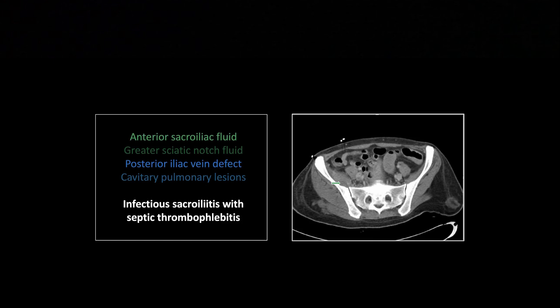This is infectious sacroiliitis — I didn't even save the bone windows because they were entirely normal. When you see that fluid collection, this is one I've shown a few times and every few years I get an email from a radiologist saying 'hey, I just saw this.' Carry it with you always — that is a great way to make the early diagnosis of infectious sacroiliitis even with normal bone windows.